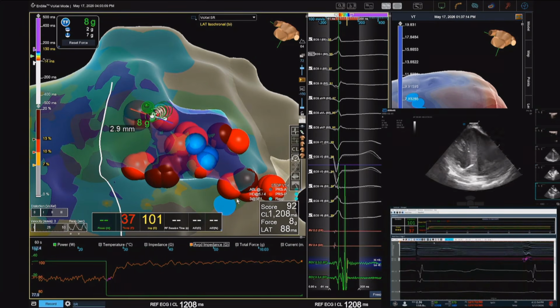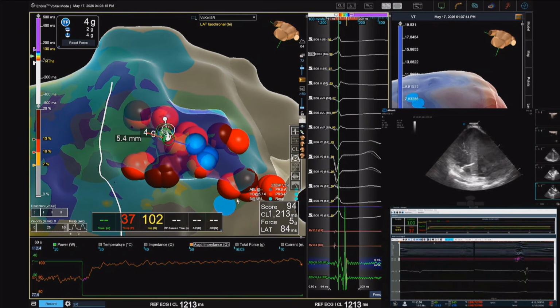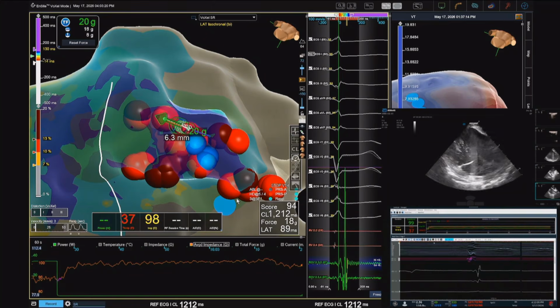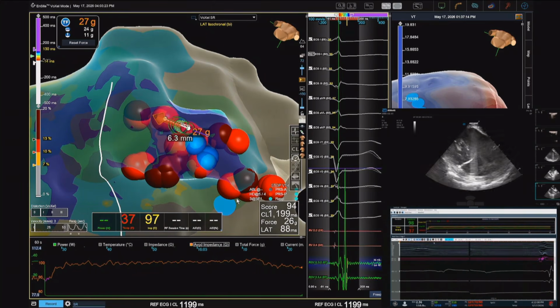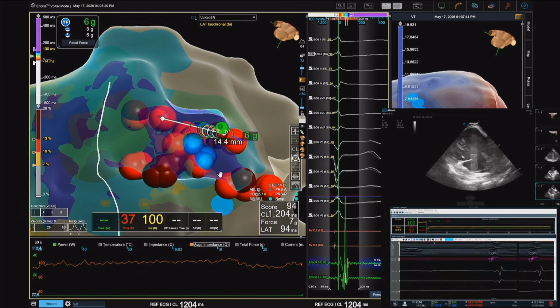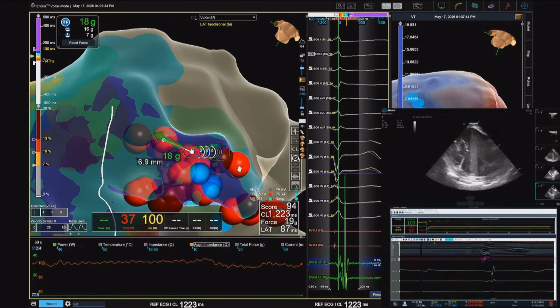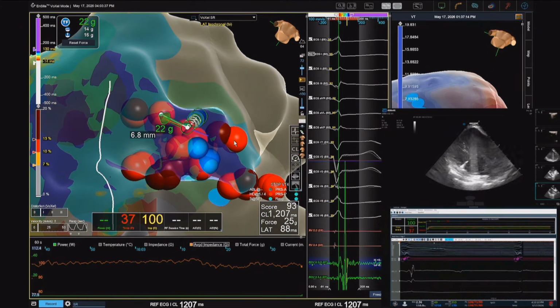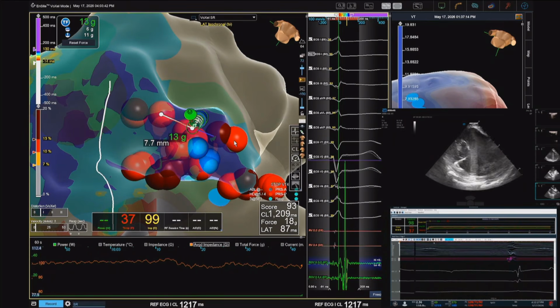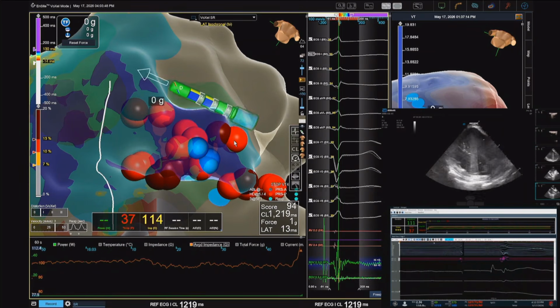In this case, for sure, if we had had PF, I would have gone to PF lesions with such a big scar. For instance, in epicardial VT, when we have a lot of fat, we had a patient with 3 ablations delivered, no more potentials here, okay, I will move. So we did another ablation in epicardium with a lot of fat, and VT stopped in the first application, and it was non-inducible after 8 stacking lesions. So it seems that in fat, PF is much better than RF. I will move because I'm stuck here. Let's move to that area.